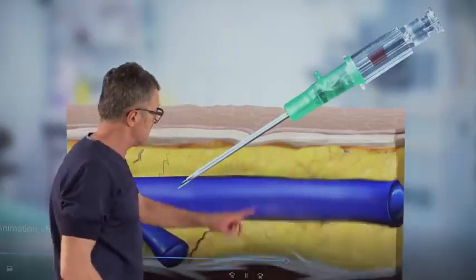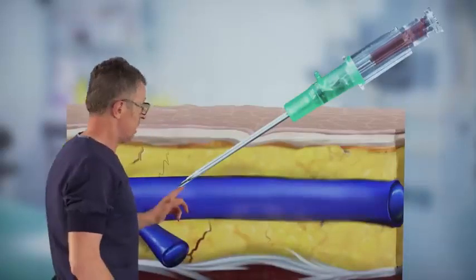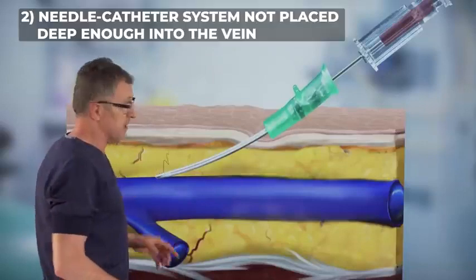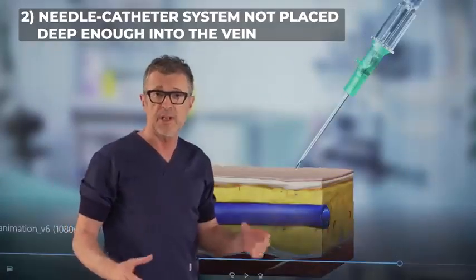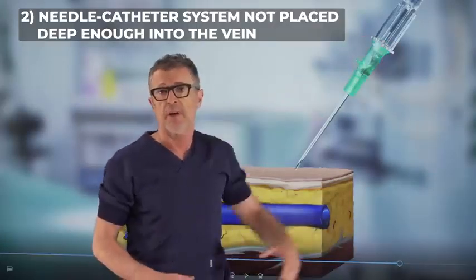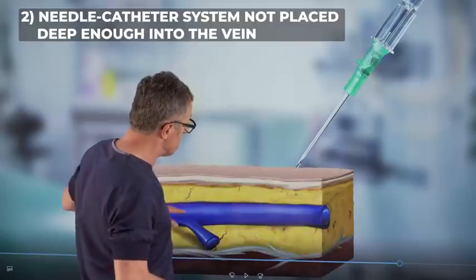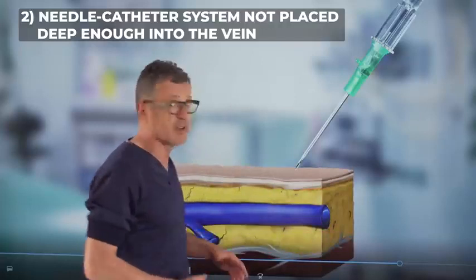But in this example, this doesn't happen. The operator is happy with the fact that this is already inside the vessel, and the attempt to feed the catheter will result in a catheter placement inside the subcutaneous tissue, but not intravenously. So that is one of the most common mistakes that you see all the time. As soon as the flashback appears, the operator is happy with the position and tries to feed the catheter over the needle, whereas in fact, you should advance it deeper inside the vein to make sure that there is enough slack and that the catheter is inside the vein as well.